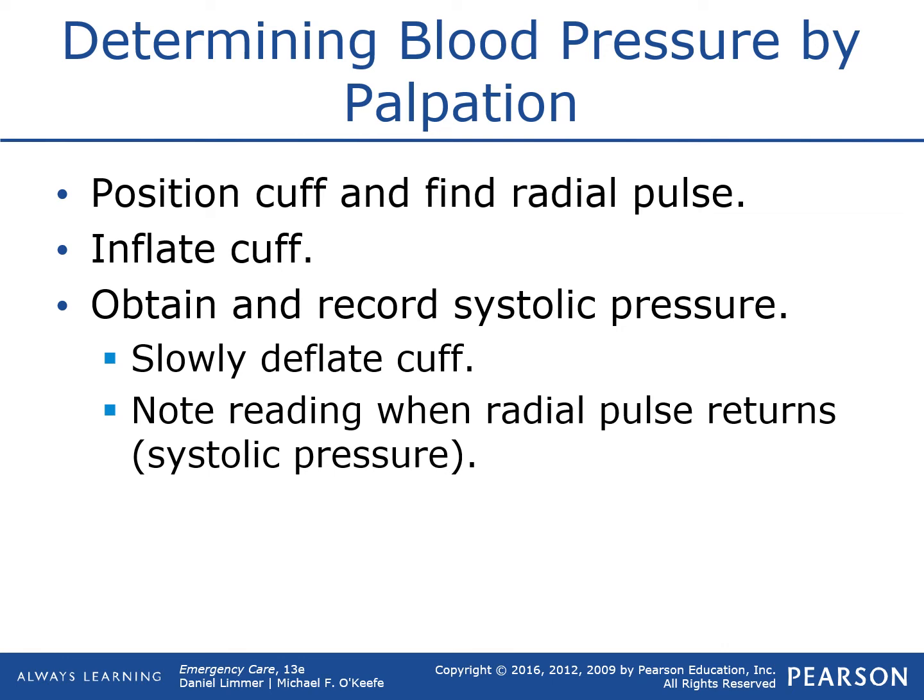We go through the same steps with the cuff, but you feel for your radial artery, then you inflate the cuff while you're still feeling for the radial artery. That radial pulse will go away once you have the cuff high enough, and then you start to release the pressure, and when that radial pulse comes back, that is your systolic blood pressure.